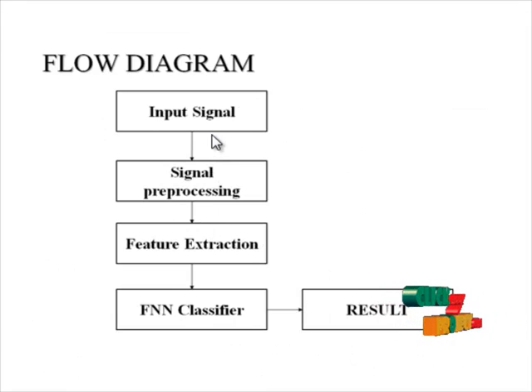Let me discuss the flow diagram for our process. In the input signal generation, we use the ECG signal as an input signal. The ECG signal needs to be generated for processing and analyzing. Read the input signal in the represented format. It is shown as an ECG waveform, with mean subtraction, 5-order moving average filtering, high pass filtering, and low pass Butterworth filtering. A typical ECG signal depicts a series of waveforms which occur in a repetitive order.